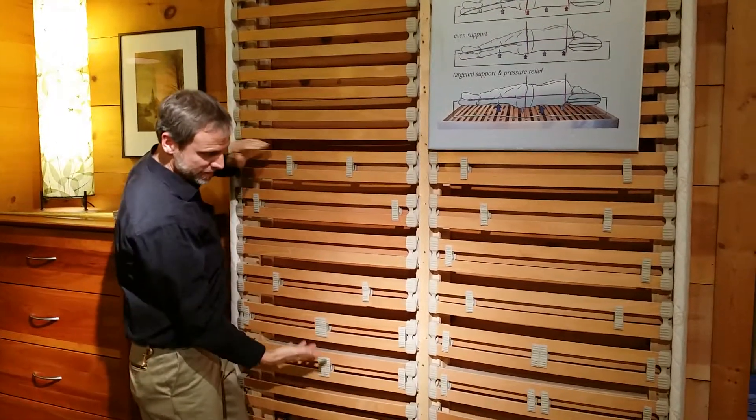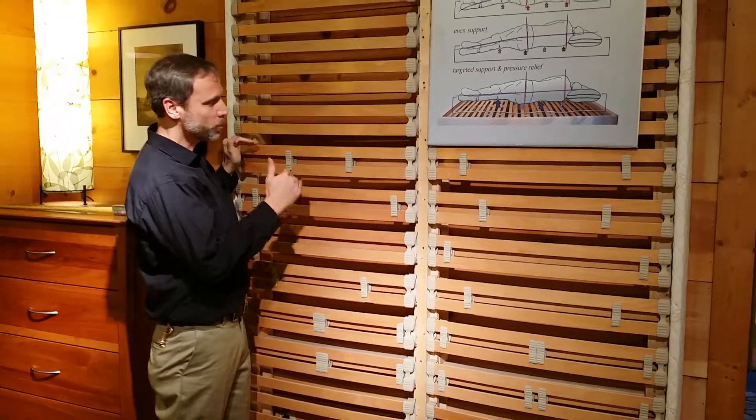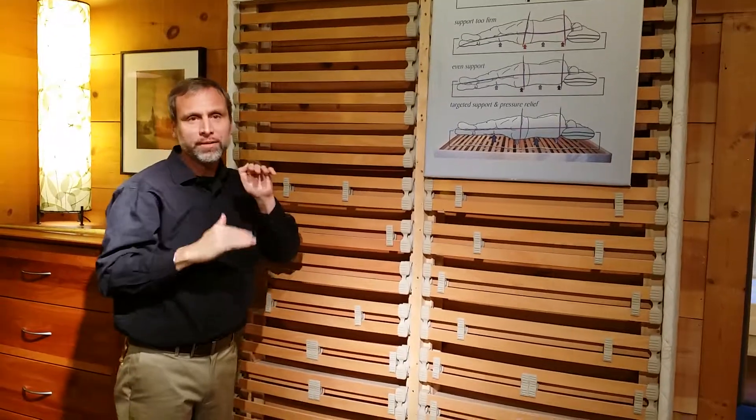We're going to talk about bringing the slat system up for a shorter person. So if someone's really short, their heads typically wind up up top and they're kind of out of alignment. What is short? Under five feet.